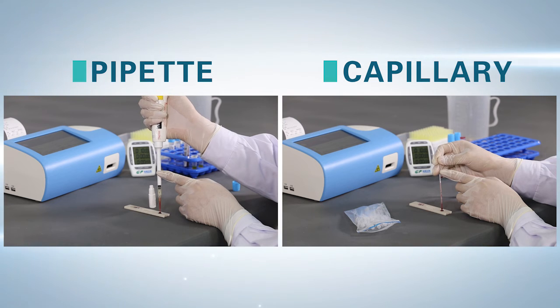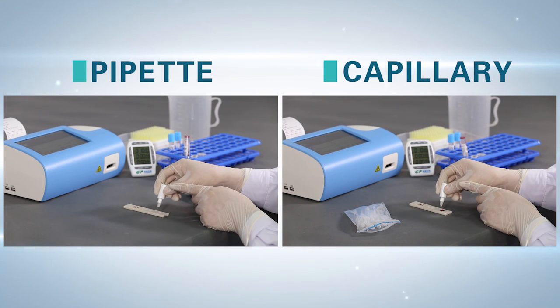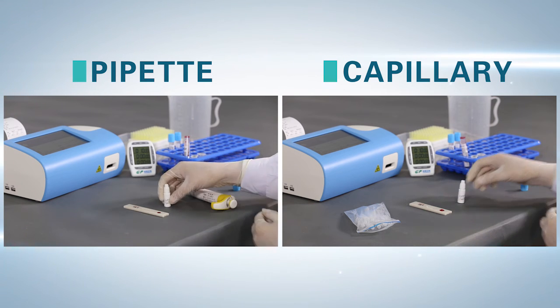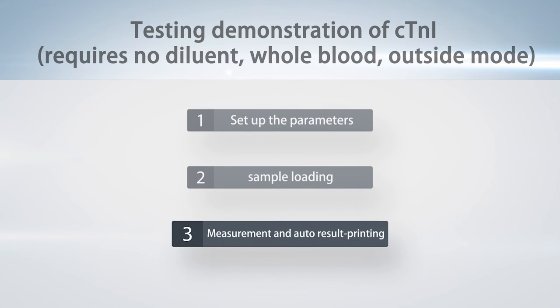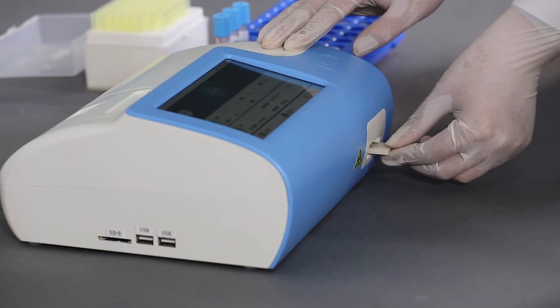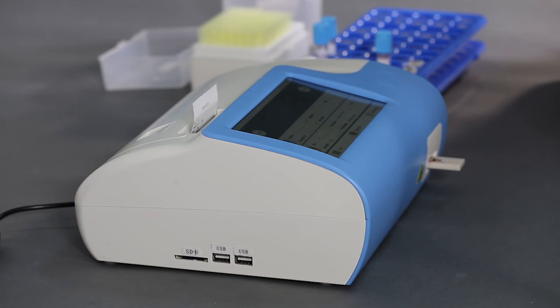Add the sample to the test card, then add a drop of diluent and count down 10 minutes for the reaction. Step 3 — Measurement and auto result printing: after the reaction, insert the sample card into the test port and press Start or click Measure to test. Results will print automatically.